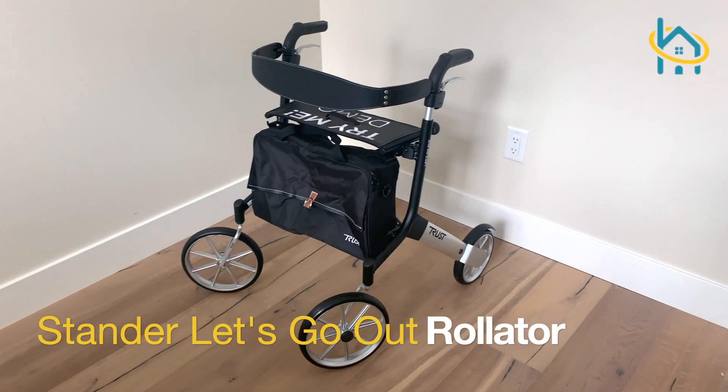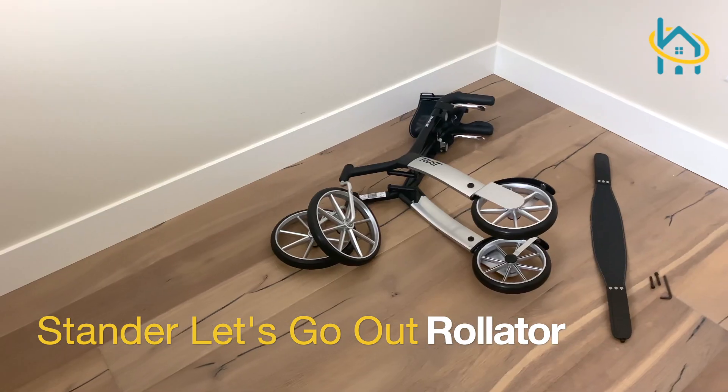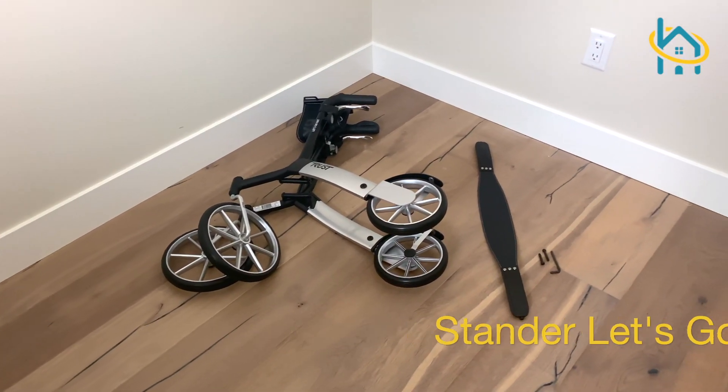The Let's Go Out Outdoor Rollator is lightweight, smooth and steady. Let's go over how to set it up.